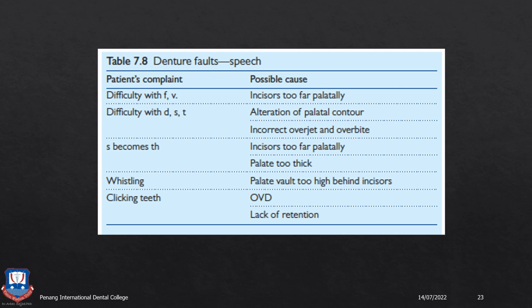So this is a table which shows basically what I told you just now. If the patient has difficulty in pronouncing linguodental sounds or labiodental sounds or sibilants, then you know what the problem is. And also you have to check for clicking of the teeth. If clicking of the teeth is there, that means the vertical dimension is increased, and or the dentures are loose. While speaking, the denture slowly comes down, and the clicking of the teeth is heard. So all these things need to be verified beforehand at the trying appointment, before the finalization of the denture processes.